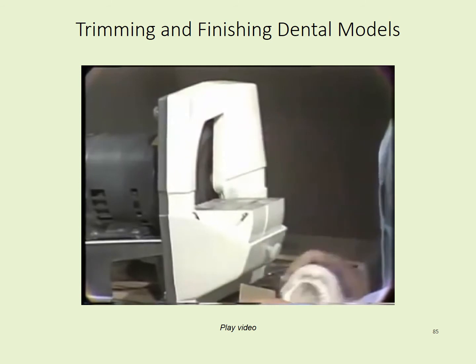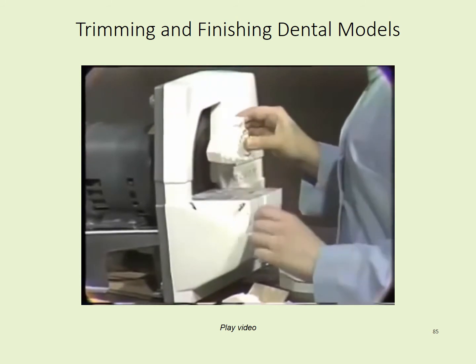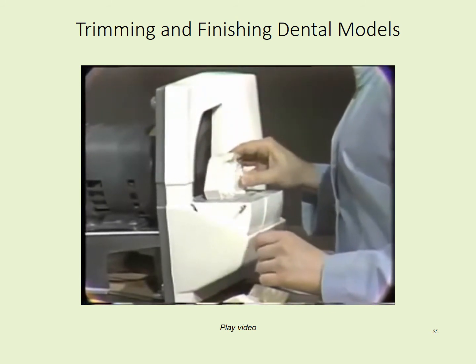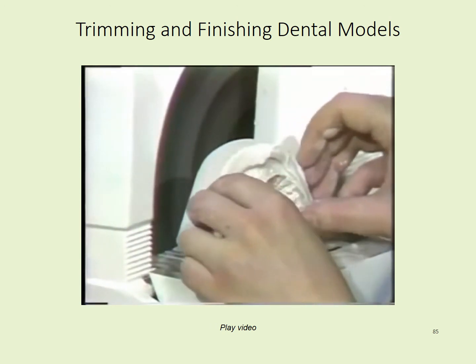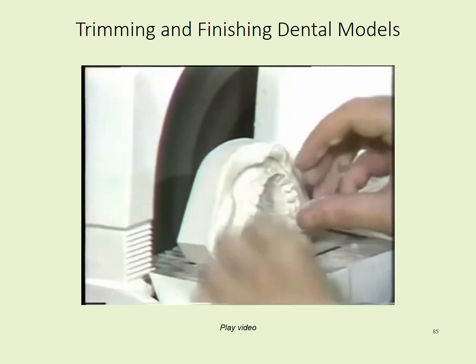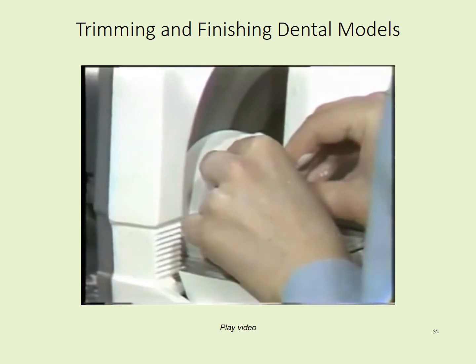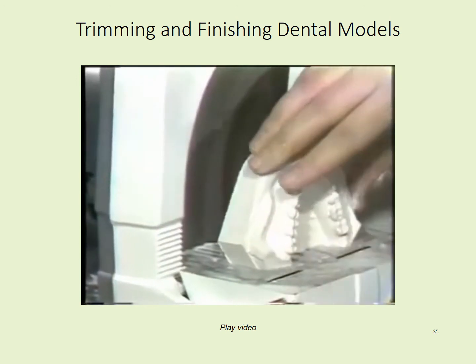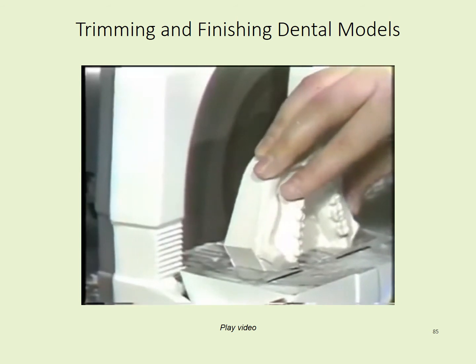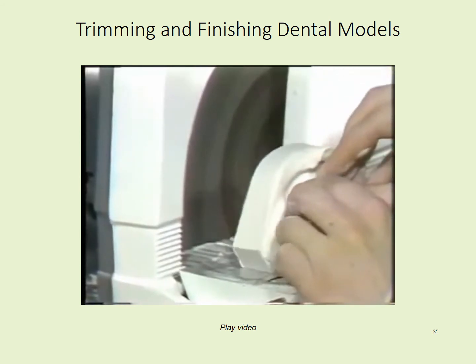After you have the backs trimmed evenly, you should trim the base of your model. Set the back of the mandibular cast flat on the table of the model trimmer, and trim the base. Make sure that you keep the back of the model flat on the table, and this will ensure that your cut on the base will be perpendicular to the back.